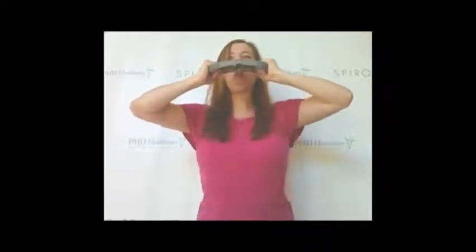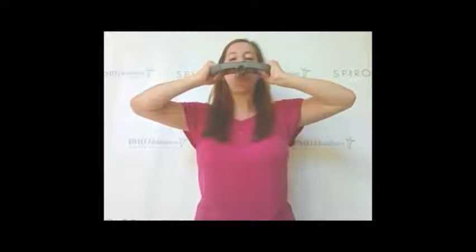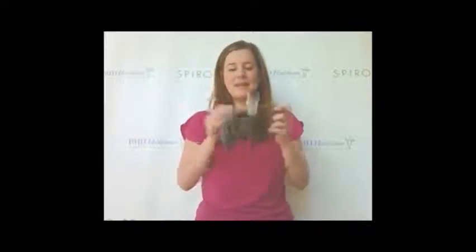Take a deep breath. Exhale now. Keep going. Keep going. Good effort. You have completed 1 of 3 tests. Press the Run Test button when ready for your next test. Take a deep breath. Exhale now. Keep going. Keep going. Good effort. You have completed 2 of 3 tests. Press the Run Test button when ready for your next test.